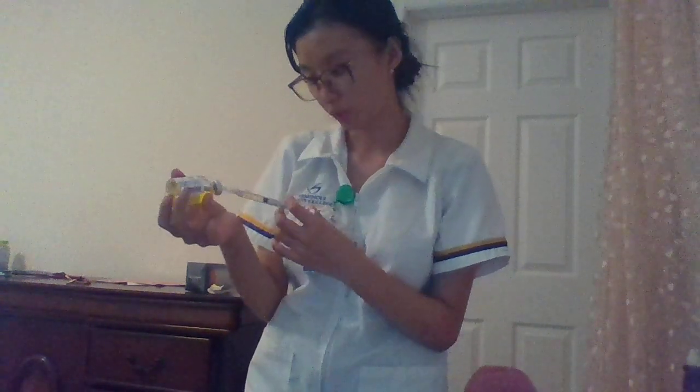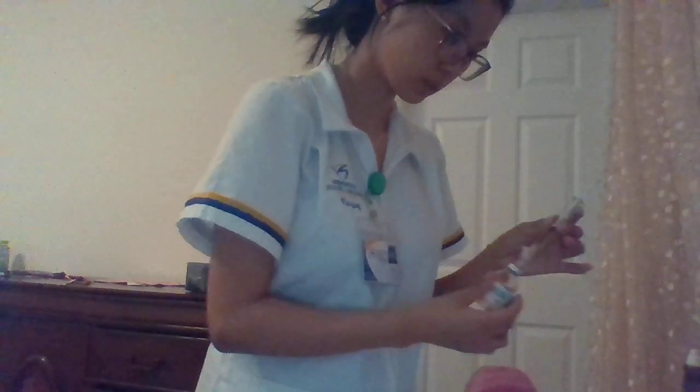I draw a little bit more than 0.5, and there are some air bubbles, so I flick it and pull the extra medication out, to ensure there are no air bubbles. Okay. So it's 0.5 now.